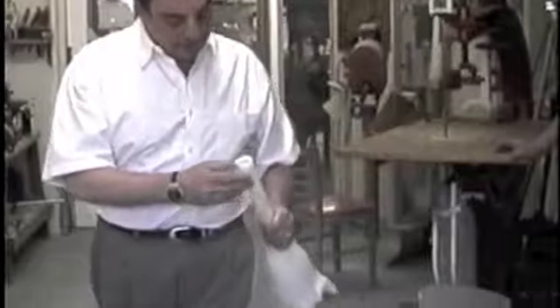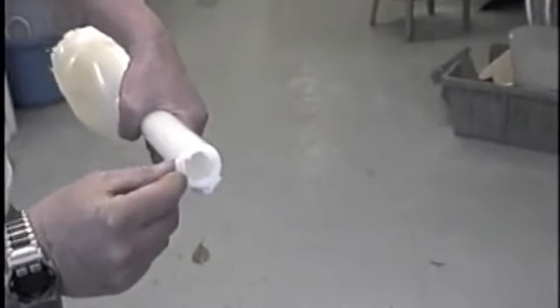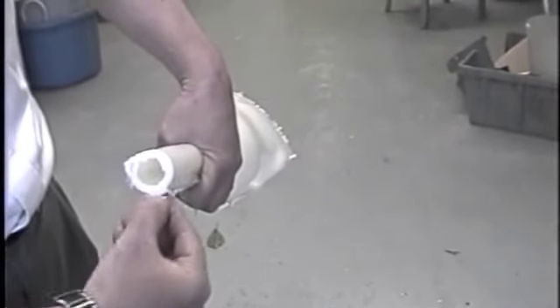Now if you look down inside the pylon, now is when you want to examine the pylon. And you see that little tiny groove in there? I don't know if you can see it, probably maybe on that angle. That's what you call a very mild trough. Now that's definitely acceptable, but if you have too much moisture, that trough is going to get deeper and deeper, and it's going to affect the area where your pylon wall is joined.